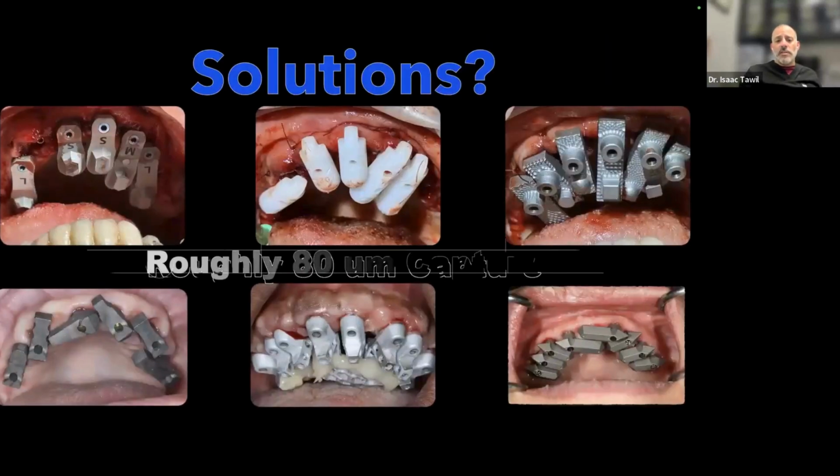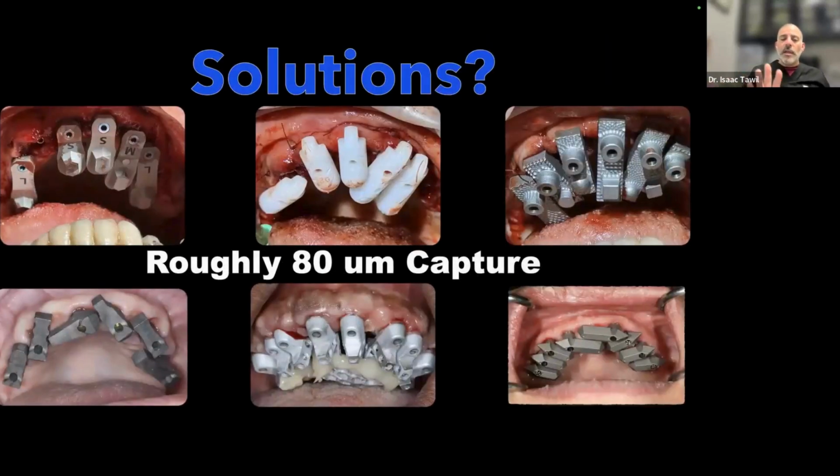I helped to develop the IO Connect system, where I helped them. I didn't develop it. I helped them improve the IO Connect system. There's the Glidewell fast scan bodies at the top. There's Scan Ladder. I developed those ones on the bottom left. That's the Arch Bridge. I wrote the first paper on the bottom one called the OptiSplint.